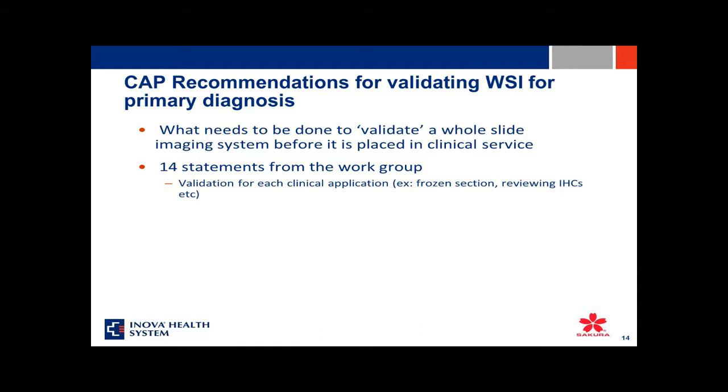They say that validation for each clinical application is necessary because different types of specimens have different capabilities. So you have to validate your frozen sections in a different way than you validate your IHC slides. And then they also say that your entire system must be validated. It's not necessary to validate each component, like you don't have to validate your imaging system, computer, monitor, etc. Everything has to be validated together.